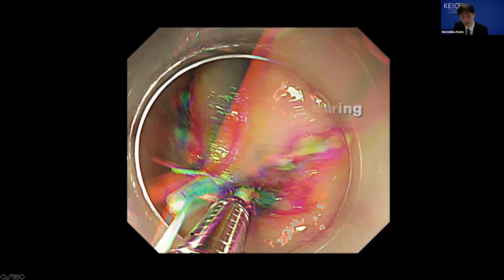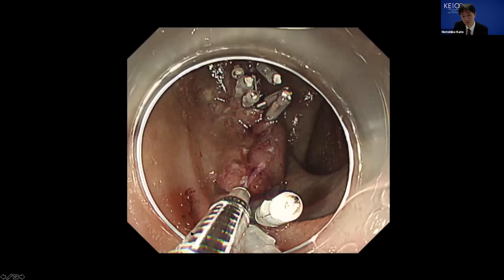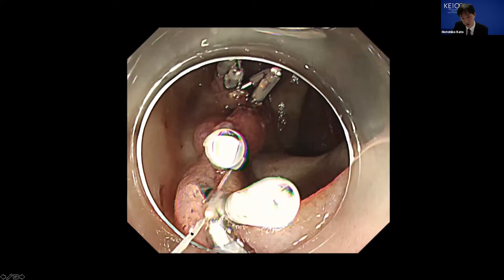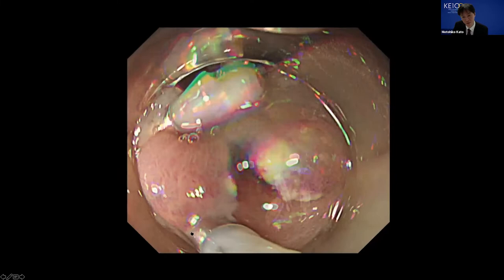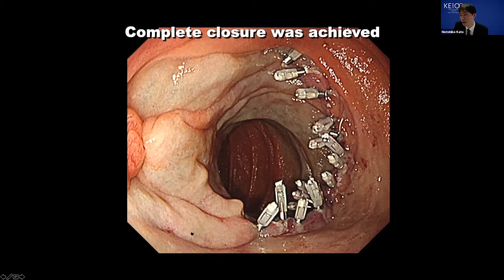After that, we cut the string using scissors forceps, and sometimes we add the next clip with string. If you clip and approximate the mucosal defect, it is much easier to add further clips. Finally, we achieved complete closure for this large mucosal defect, and this patient was discharged without any adverse event.